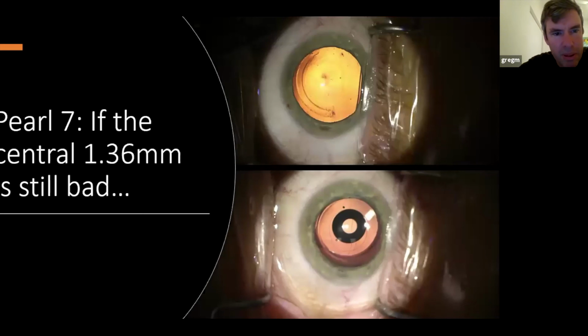The other point I'd make is that at this point in time, there are possibly other sizes available, but you're only isolating the central 1.36 millimeters of the visual axis. That's around the central 1.6 millimeters at the corneal plane. And if that is still a rotten area of cornea, you're still going to perhaps not have a magical visual effect.